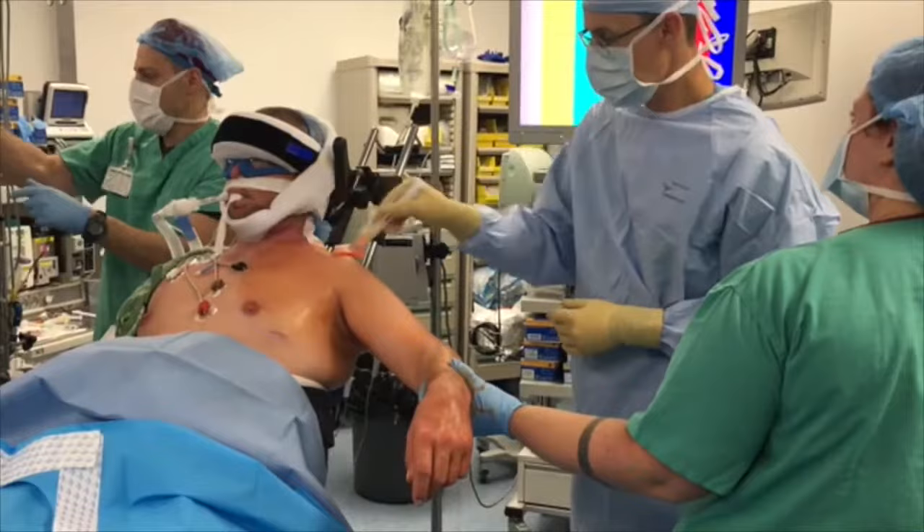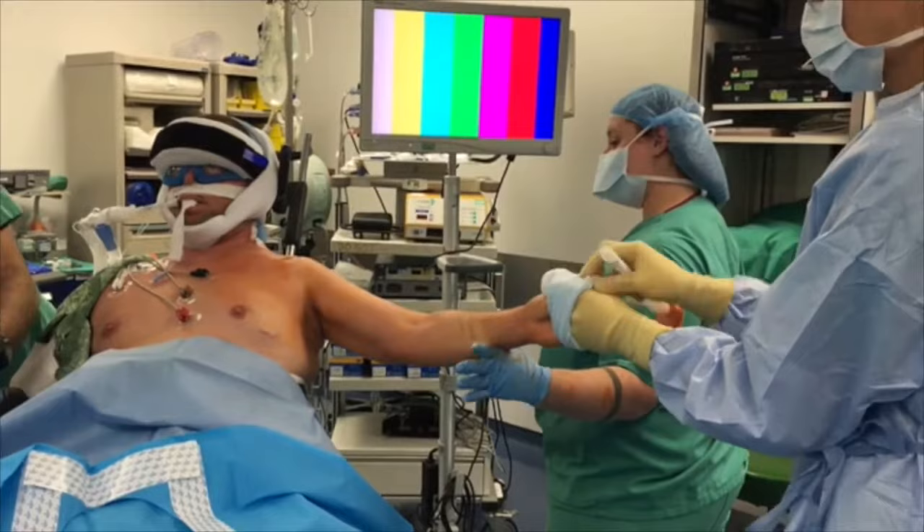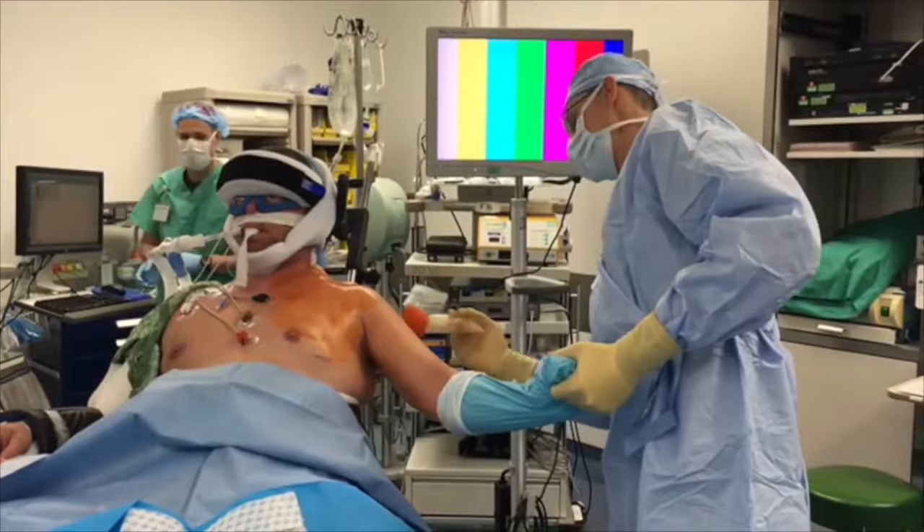Preparation and Draping: An unscrubbed assistant will hold the forearm of the operative extremity while the scrubbed surgeon uses sterile 3M DuraPrep surgical solution to clean the skin from the axilla to the hand and from the nipple to the medial border of the scapula. The surgeon then uses a sterile stockinette made by 3M Healthcare to grab the hand while cleaning the area previously held by the unscrubbed assistant with 3M DuraPrep surgical solution. The patient must then be draped.